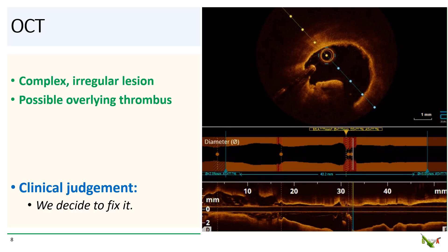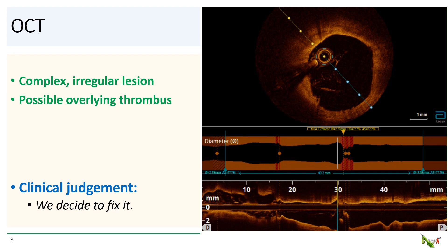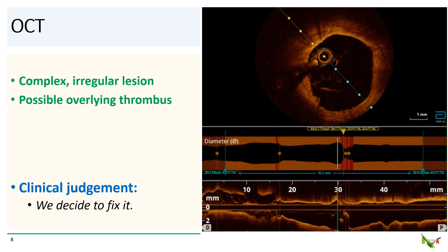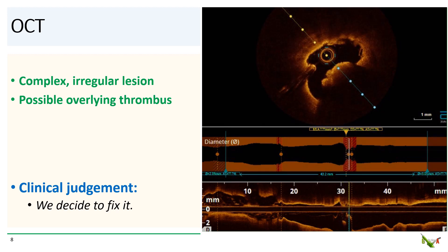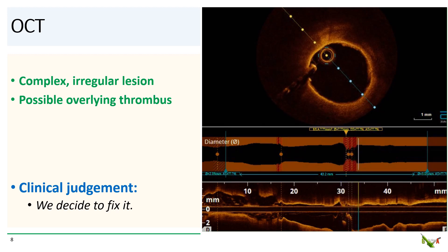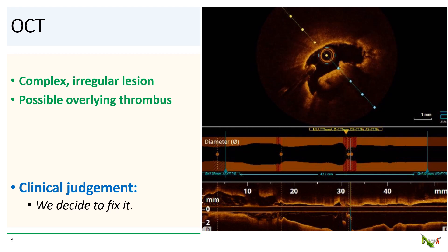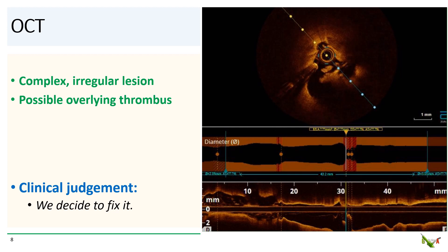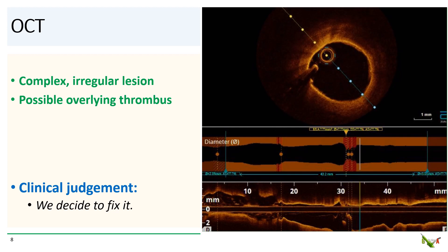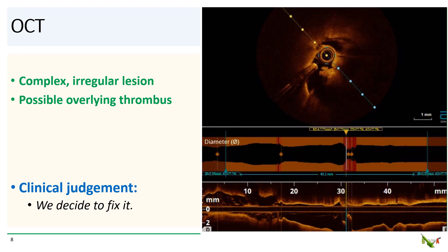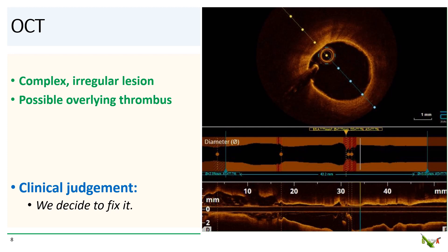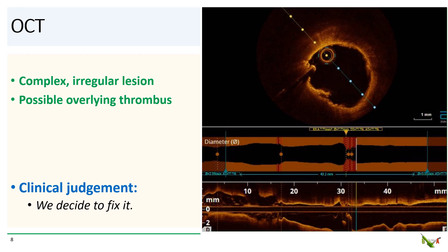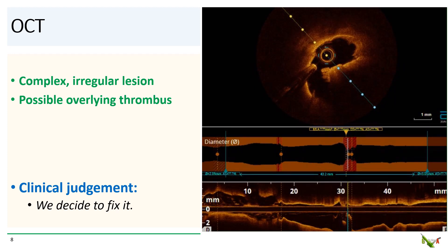Given the muddied waters with using FFR in SVGs, what should we actually do with this patient on our table? We decided to go ahead and use OCT to take a closer look at the lesion. On OCT, that slit-like lesion looked like a very complex and highly irregular lesion that was very stenotic. It also appeared quite unstable and had a possible overlying thrombus. This SVG supplied the entire posterior wall of the heart, so it was hard to leave it alone. Our best clinical judgment was to actually fix it.